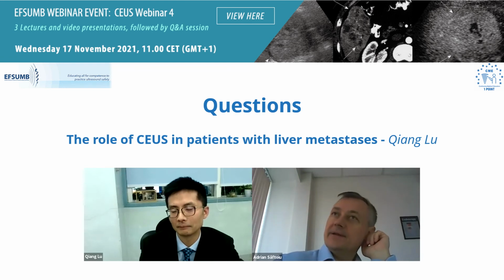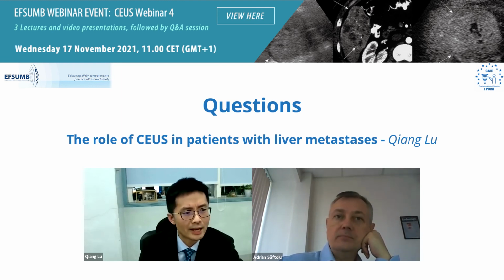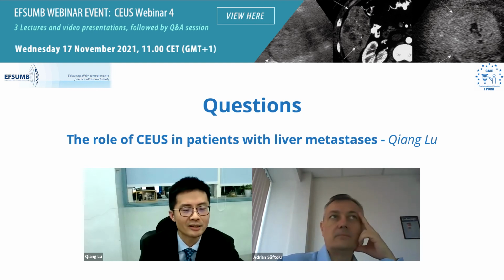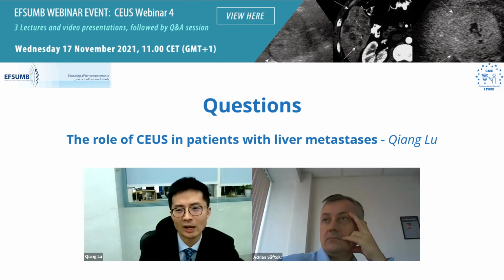Okay. There's another question in the chat. What is the accuracy of contrast-enhanced intraoperative ultrasound for colorectal liver metastases in your experience? Are you doing it, and what's the accuracy? Yeah, I did some of the cases in the operation room, and I think contrast-enhanced intraoperative ultrasound has the highest accuracy among other imaging modalities, and almost near 100%.